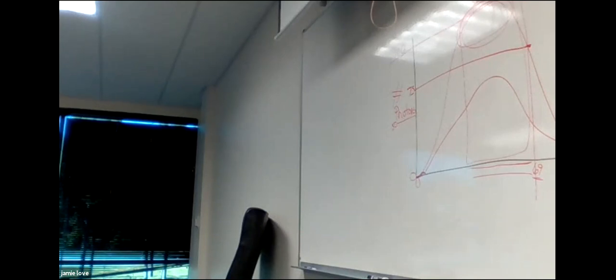Adding tube filtration, at the bottom chart, from 2 millimeters to 4 millimeters. More X-rays made it through with less filtration. Adding filtration is reducing the number of photons. So the graph for 4 millimeters is low on the numbers, high for the 2 millimeters. Also, the energy changes. Adding filtration moved our green one over to higher energy, because adding filtration increases our average energy. So the average energy of the beam moved over and went up.